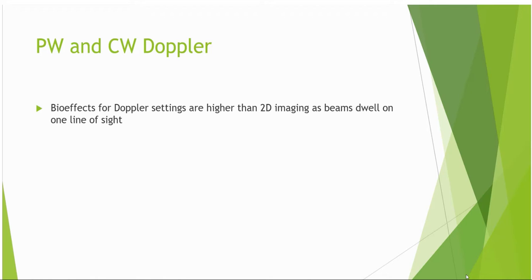We're all familiar with pulsed wave and continuous wave Doppler, how the signals are generated, displayed on the screen, and the differences between each mode. Here we'll dwell on a few concepts, some of which you may not be familiar with, and how we may adjust the settings to optimize the display.